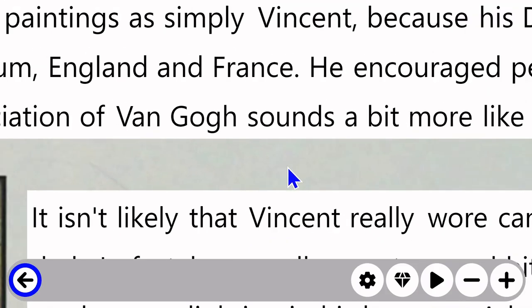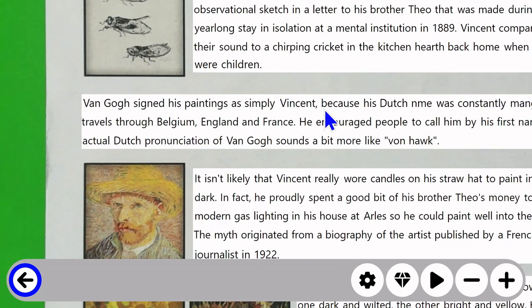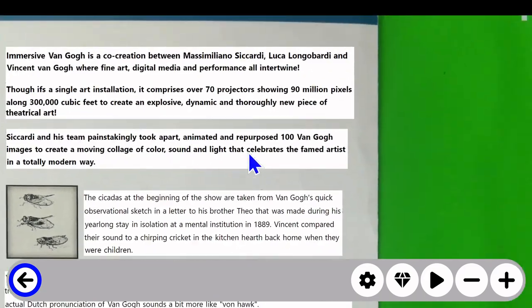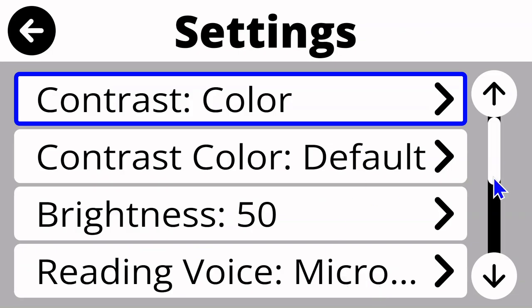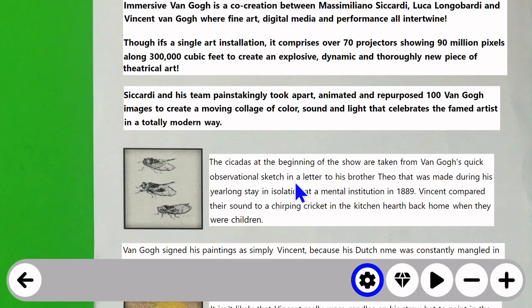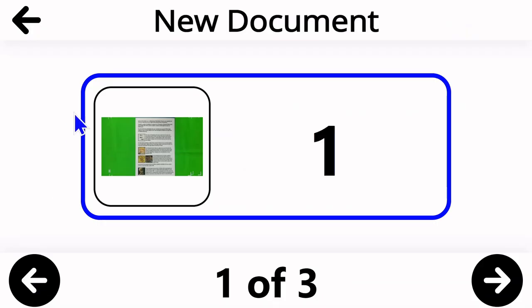So here is that very first page of the document. You can see we've captured it. We've applied our Diamond Edge text to it. It is very zoomable. I'm clicking and dragging on the screen right now, and I have available settings down here that I can utilize that we've explored in other videos and so forth. So now I have a multi-page capture here. If I hit my back arrow in the lower left corner here, I come back out to my document and basically I've got it saved.